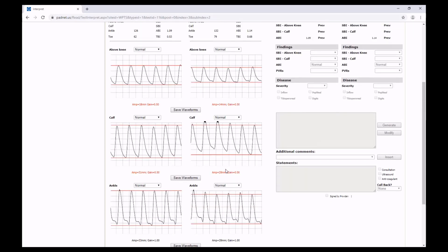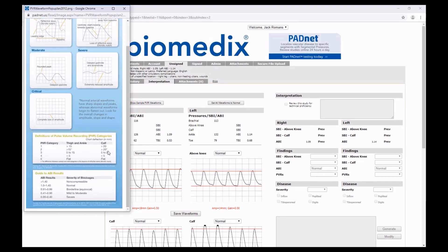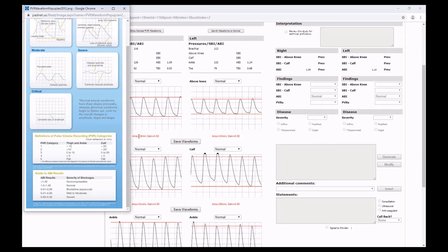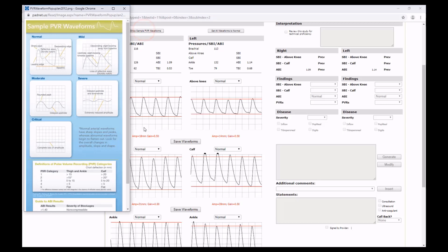When interpreting our amplitude in comparison to our Sample PVR button, these numbers are in relation to a gain of 1. So, whenever you're comparing it to a number that's in red, it means we're going to have to change it. For example, in this image, we notice that the gain is half the size. This means that the image would be twice as large, but in order for us to see the entirety of the waves, we shrunk it down to half the size. Therefore, in order to look at the original amplitude, we're going to have to adjust it by undoing the effect of this number right here. In this case, because the image is half the size of the original image, our amplitude needs to be doubled to return it to what it would be at a gain of 1. If our gain is a quarter, we need to multiply it by 4. So, this amplitude, with regards to our metric, would actually be considered 36 instead of 18, which is above our range of 15, and therefore it's considered a PVR category 1, which is normal.